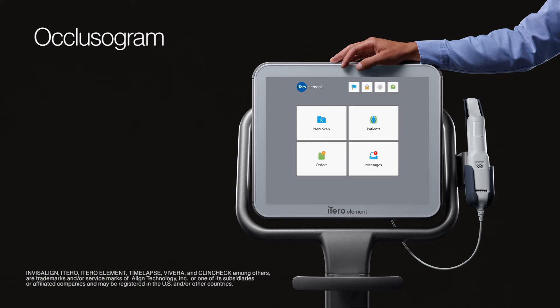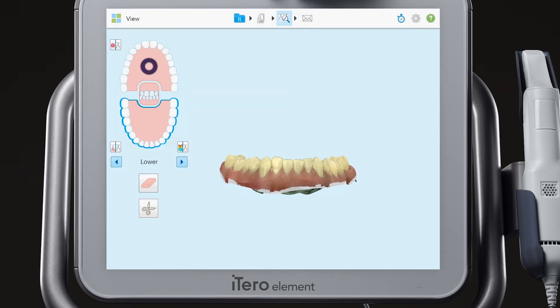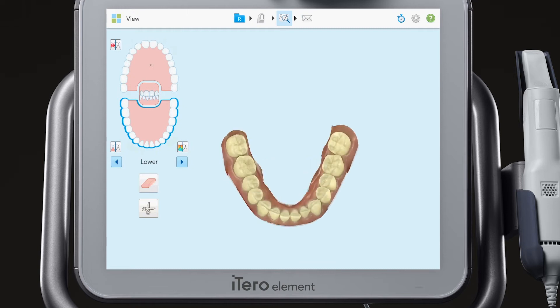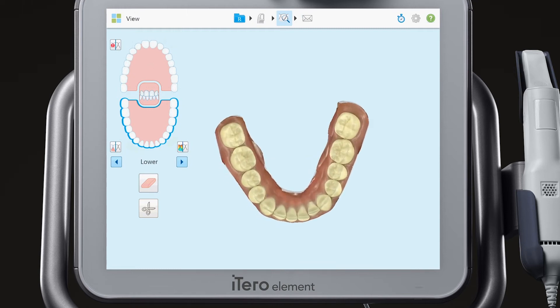It's easy to use the occlusogram with your iTero digital model for improved patient communication. Beginning with a full mouth scan, tap on the view icon. When the case is finished processing, tap off the arch that you do not wish to evaluate to show only the arch for evaluation.